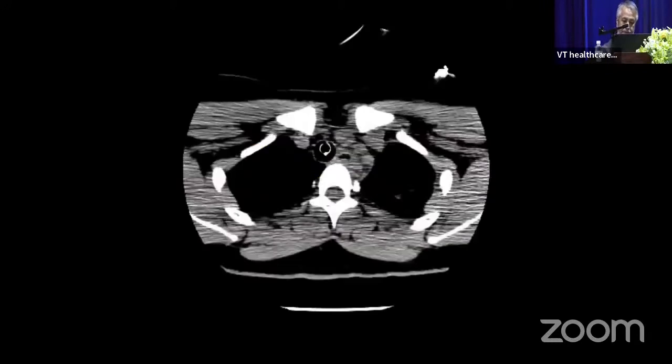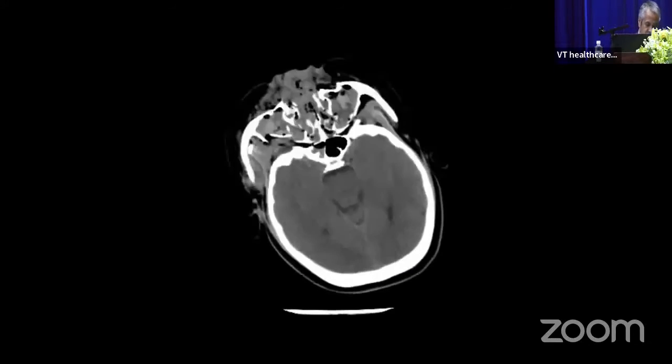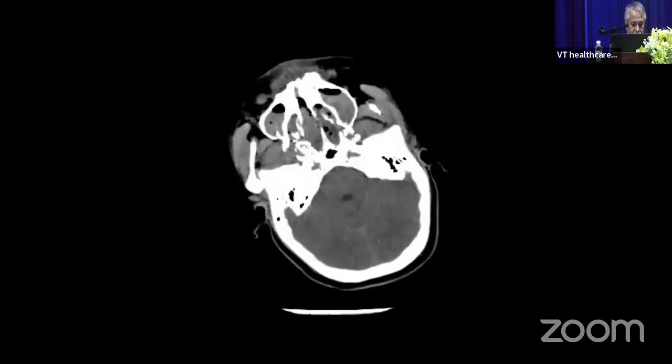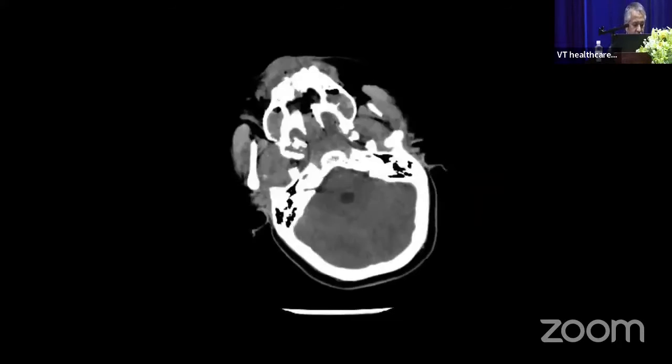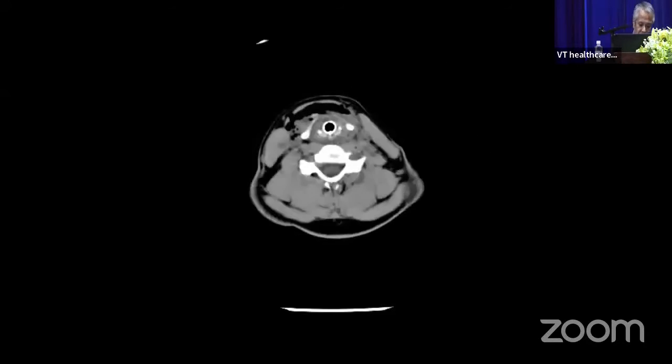Emergency room. Facial trauma. The condition of the damage can be understood to some extent from the CT image, but there is little detail and information about the fracture.